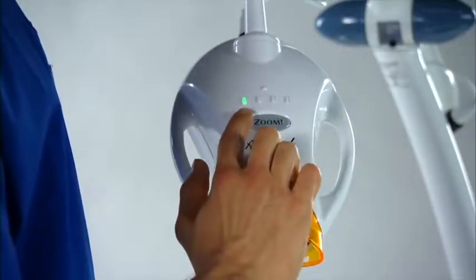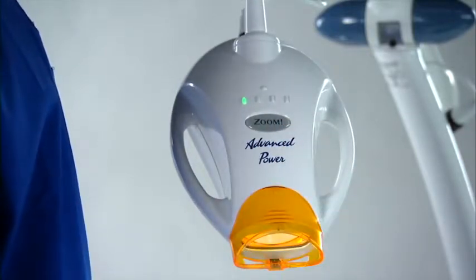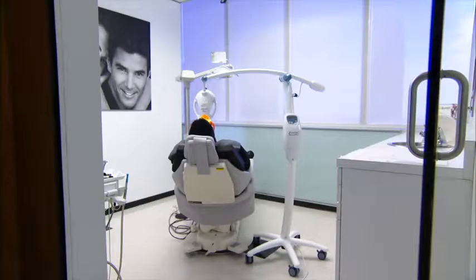Point out to the patient that the progress of each session will be tracked by the 4 lights on the top of the lamp head. A light will appear for each quarter of the session. These lights are also helpful for checking on the patient's progress and time remaining.